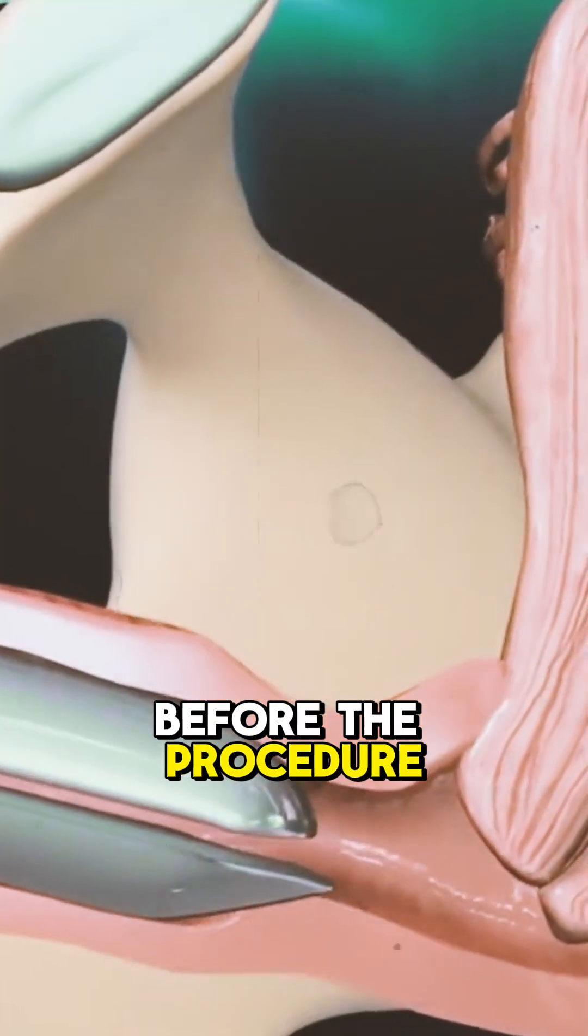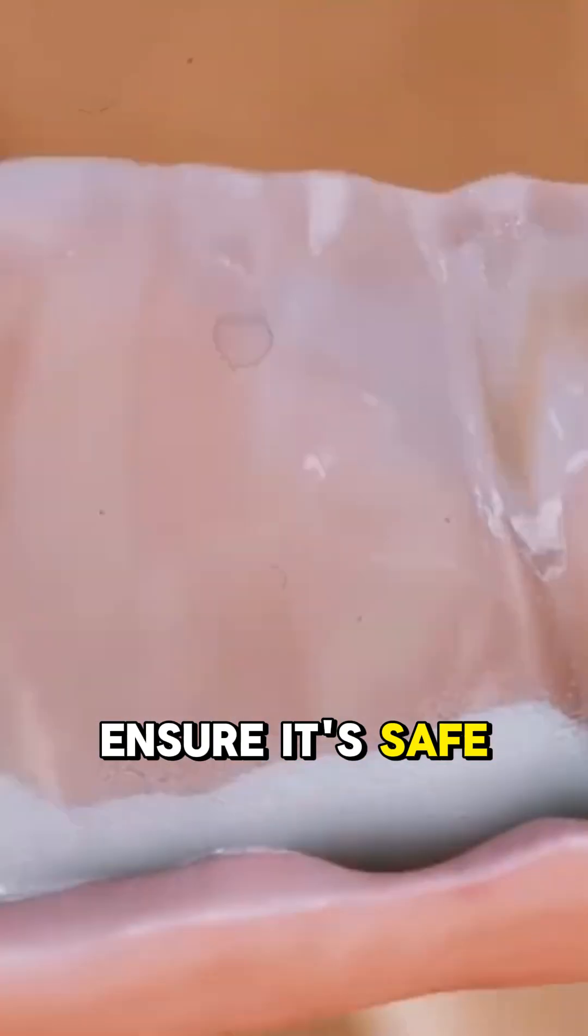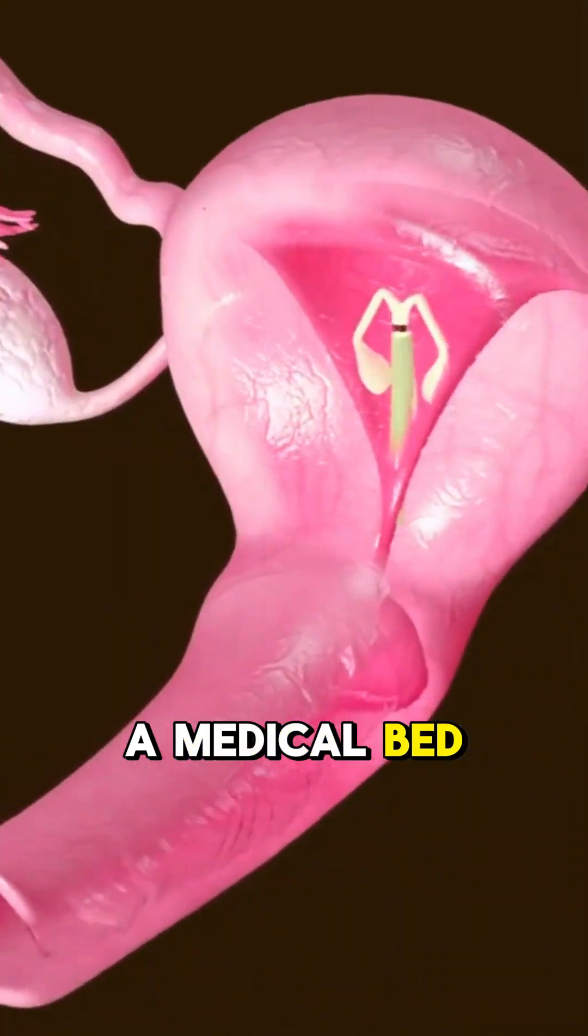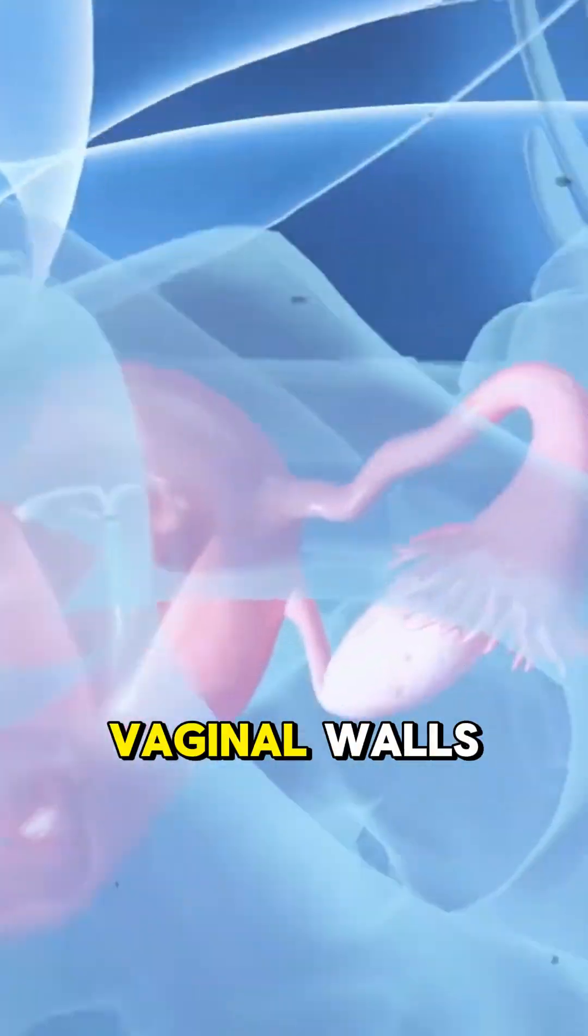Before the procedure, doctors check your medical history to ensure it's safe. Then, during insertion, you lie on a medical bed. A device called a speculum is used to gently open the vaginal walls.